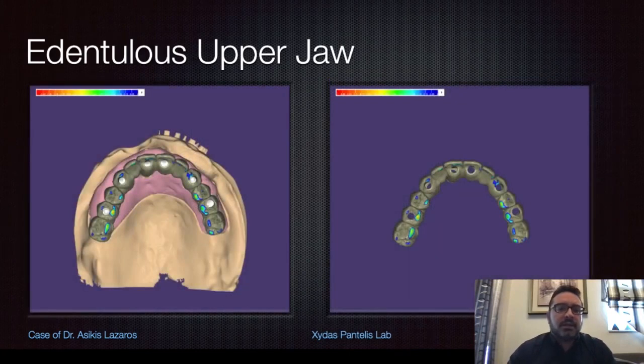These are the STL files that are going to be produced from the Exocad software. As you can see on the left screen, we can see the holes, or the scan abutment if you prefer, that we have from the R2Gate software. And on the right screen, these are the holes that the temporary has to pass and be engaged in the mouth of the patient.